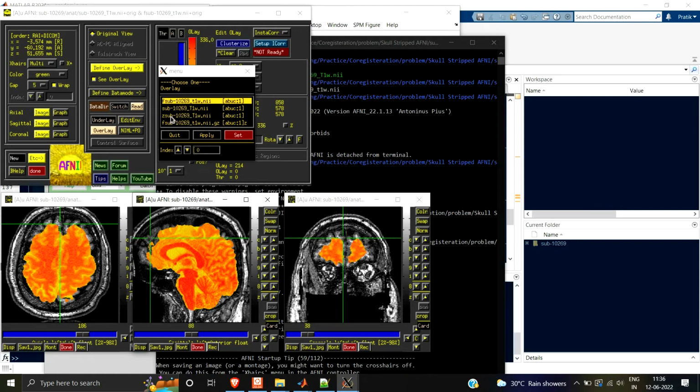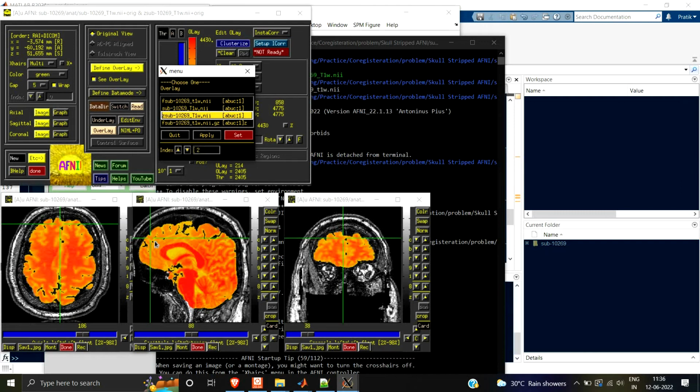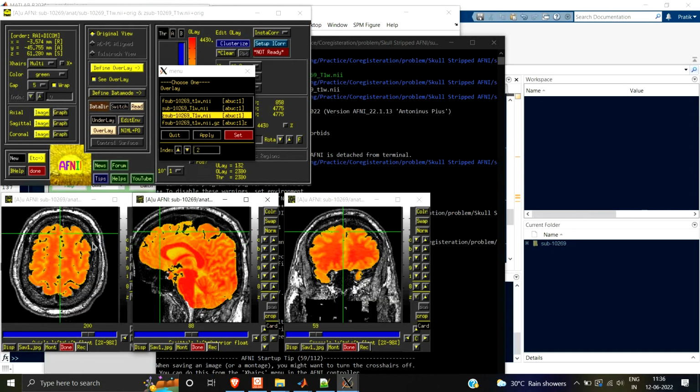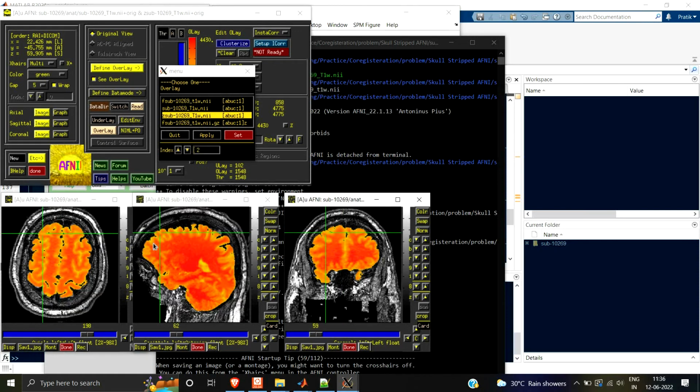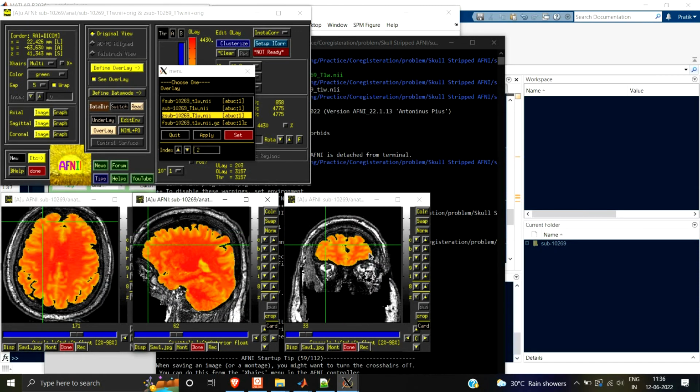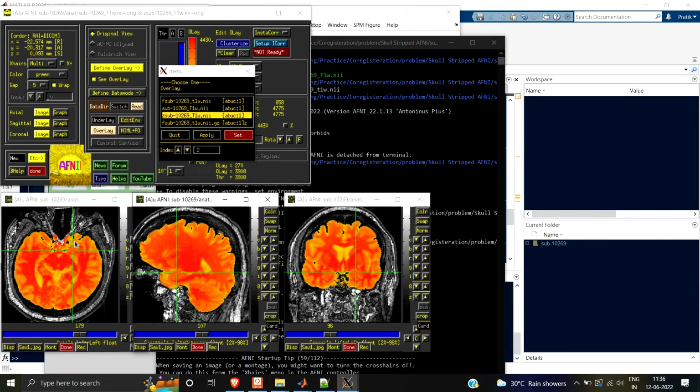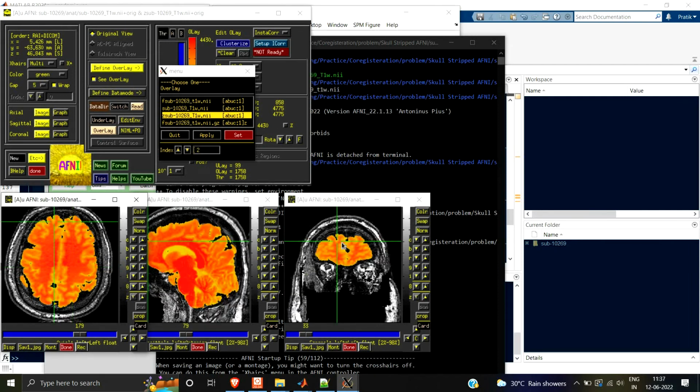On the other hand, if you see the AFNI output, you can see AFNI is so perfect. So beautiful. It is taking the entire brain and it is only removing the skull and all the other different things. Right. So that is the advantage of AFNI. AFNI is very accurate, but it may take some while.